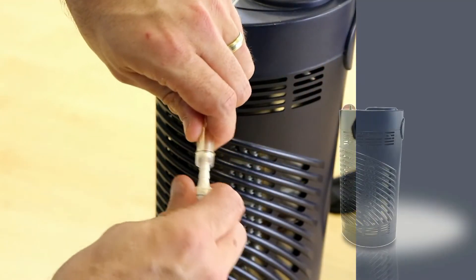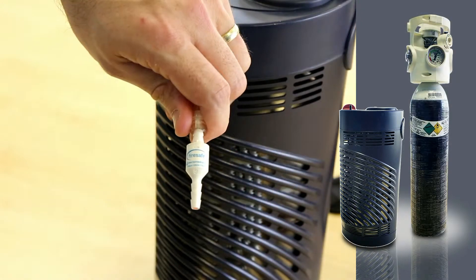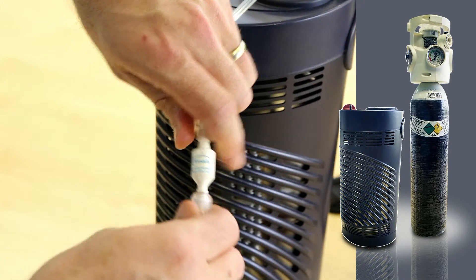Fire brakes are compatible with all oxygen supply modalities: gas, liquid and concentrator supplies.